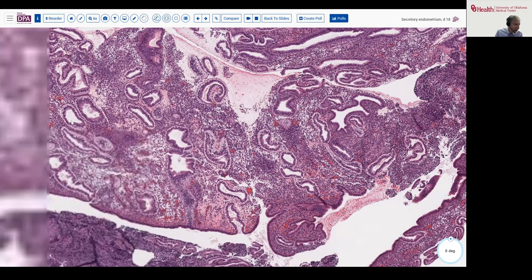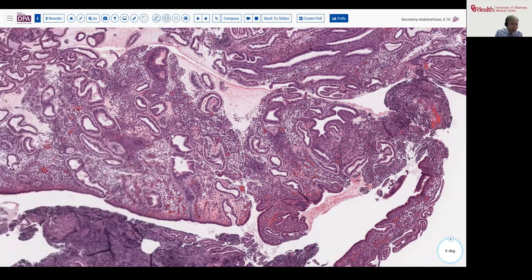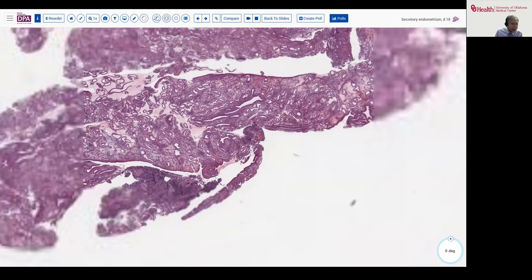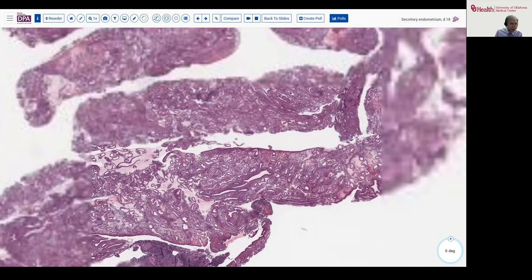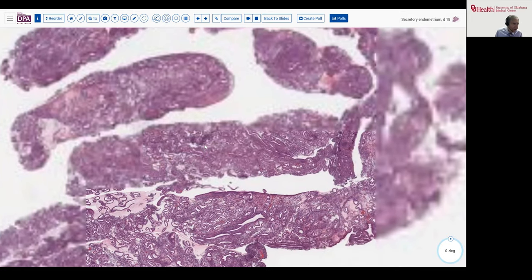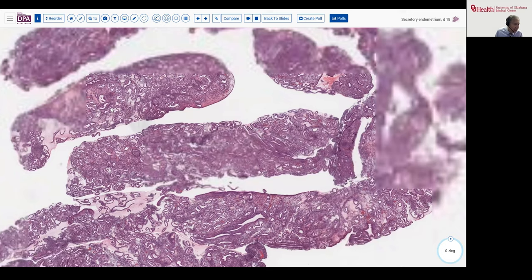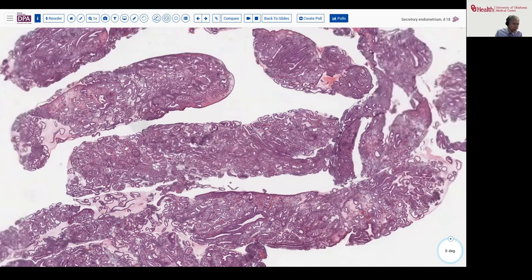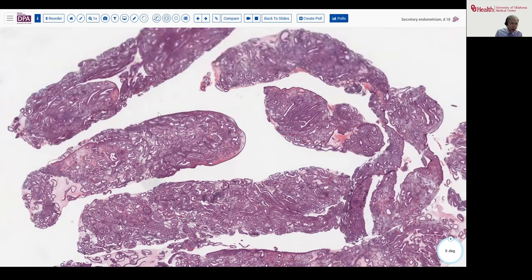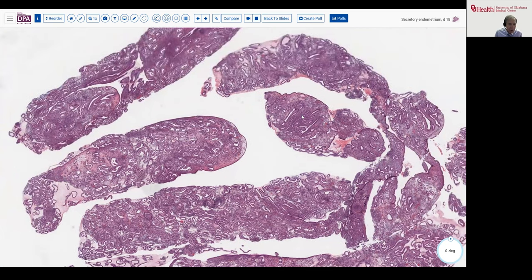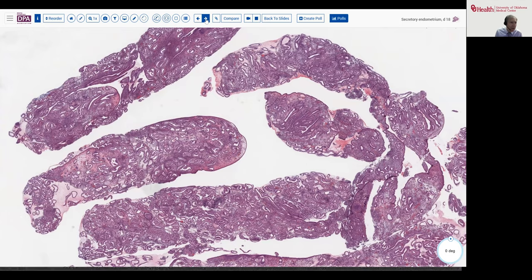You can see how all of these cells churning out their secretory product into the lumen would begin to massively dilate the glandular lumina. Now, there may be areas where you don't have hormonal responsiveness to the same degree, so you may see some basal-type or more proliferative pattern glands. But by and large, you shouldn't see more than a few days' difference between areas before you would diagnose an asynchronous pattern.